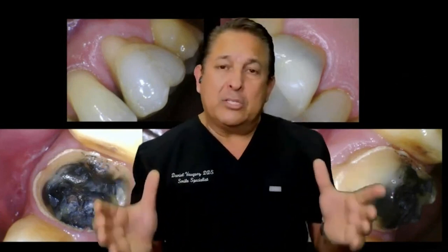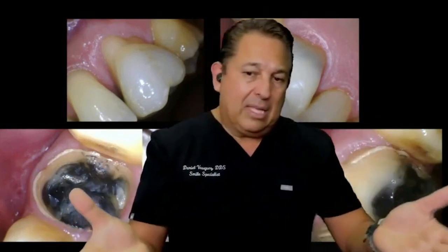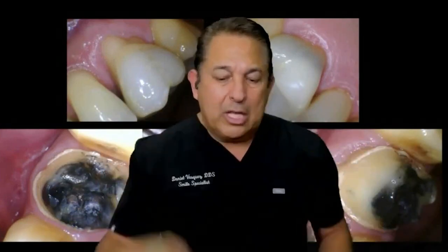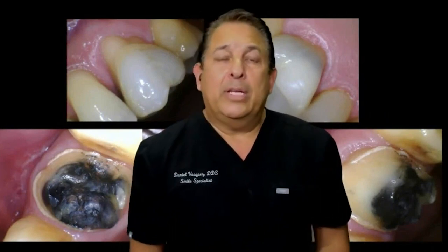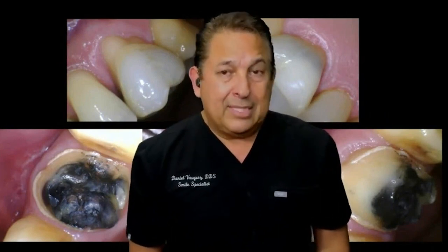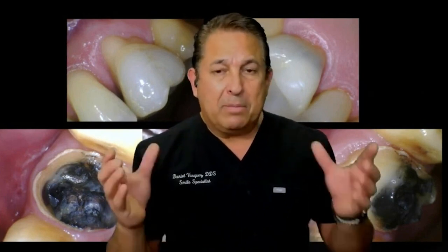And also because you're going to bond, okay? So literally, you don't need to have a defined margin. So you can put your margin, you know, half a millimeter, a millimeter on top of the CEJ and seal that perfectly fine. So that's what I did on this prep. We modify it because the material they're going to be using is going to be either a printed material or a ceramic material, but the prep is going to be the same.